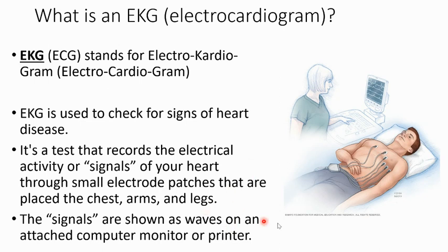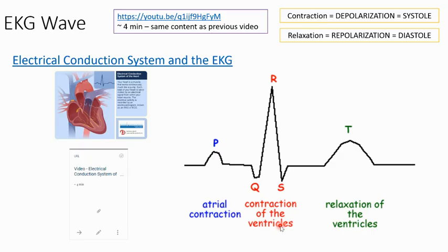signal. The signals are then going to be shown as waves on a computer monitor or printer, and then that's going to go to the physician. So again, this is one of the same videos that was in the previous objective that I encourage you guys to take a look at. So again, you need to know contraction, depolarization, systole, all mean the same thing. Relaxation, repolarization, diastole, all mean the same thing. This just gives you a short reminder of what we previously talked about in the Objective 5.